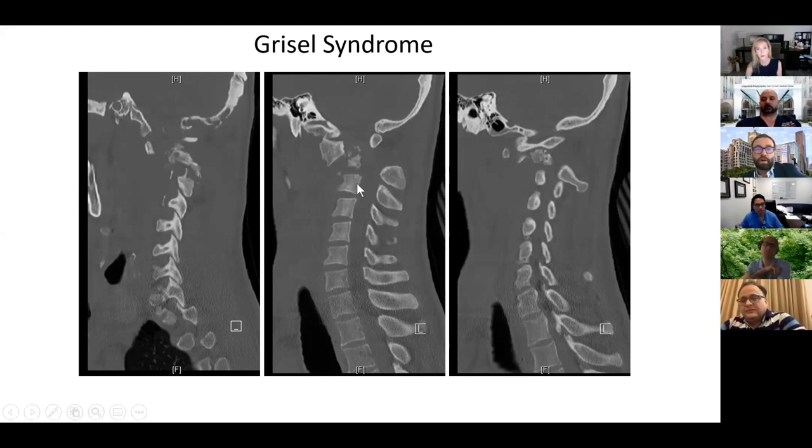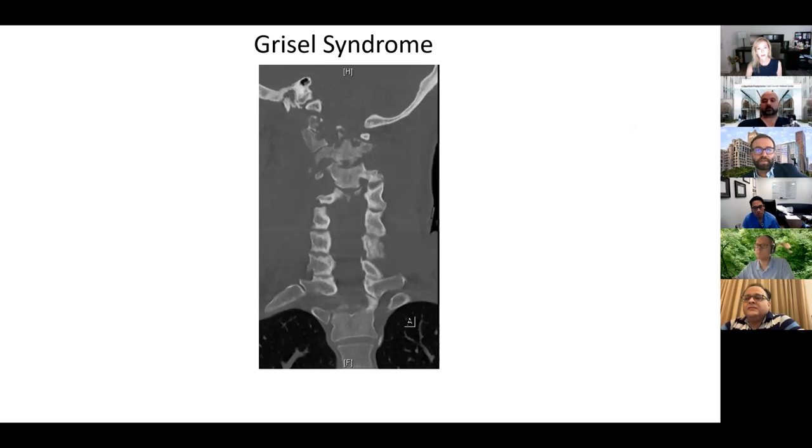Right away, they said they had added him on for surgery. I said, look, let's cancel the surgery. Let's put him in traction and try to reduce the alignment at the CVJ with traction and see if that works. That's what's supposed to be a coronal view, and you can see that the head is totally rotated. That's sagittal here, coronal here.